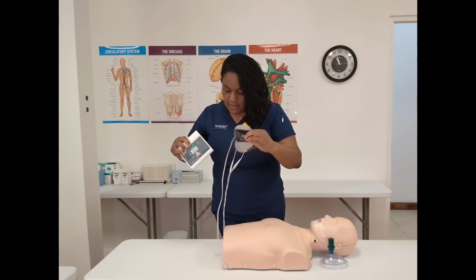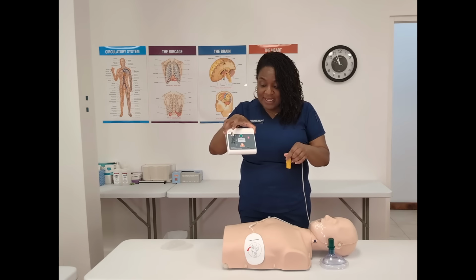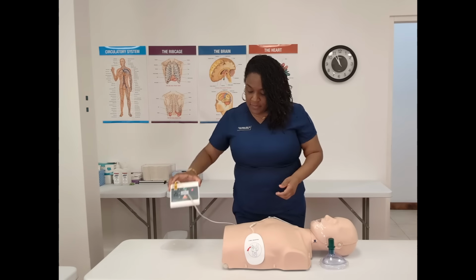Once my pads are placed, it's flashing to let me know where to connect it at. Apply pads, plug in connector. Analyzing heart rhythm. No one can touch when it's analyzing. Make sure everyone's clear of the patient. Everybody's clear?